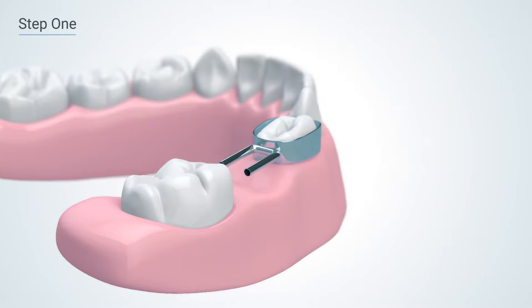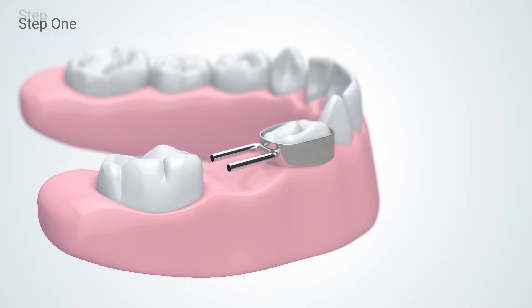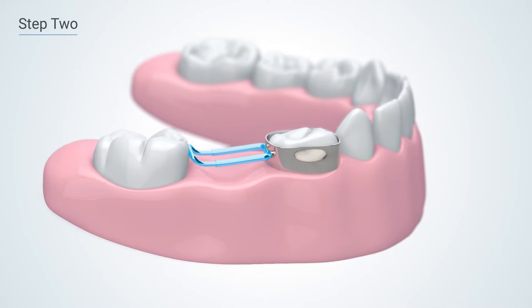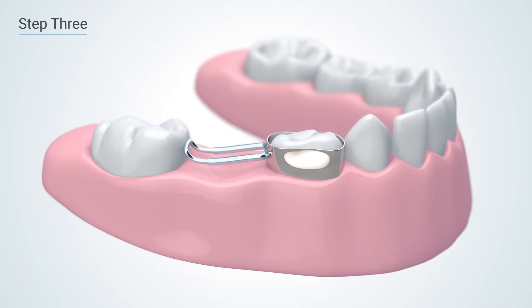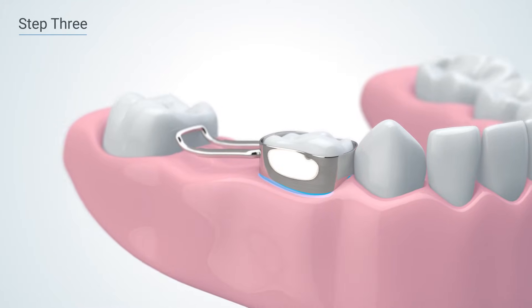Step one is a trial fit with the space maintainer band or crown. Next, you'll insert a wire, sized to the gap, and crimp the tubes. Then finish by cementing the appliance in place. Now let's talk about these steps in more detail.